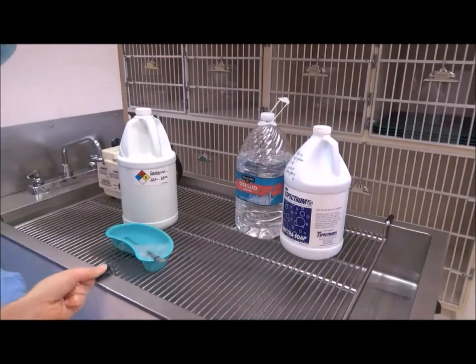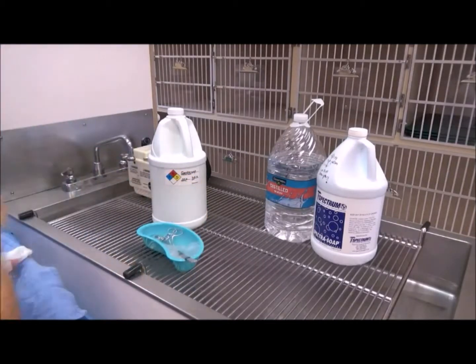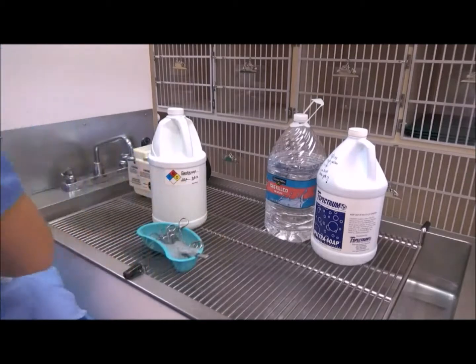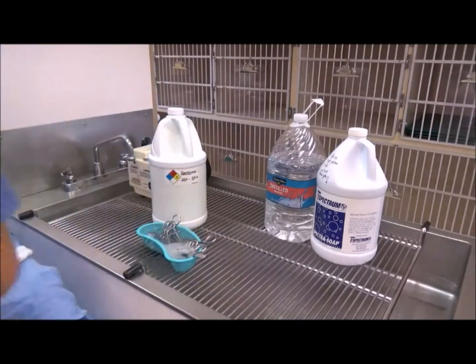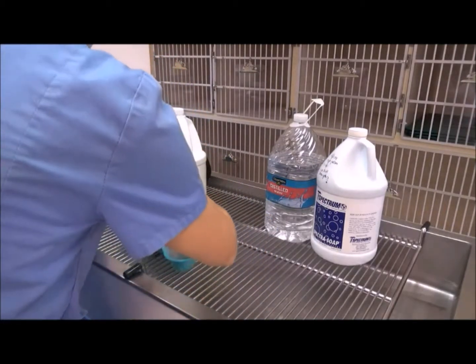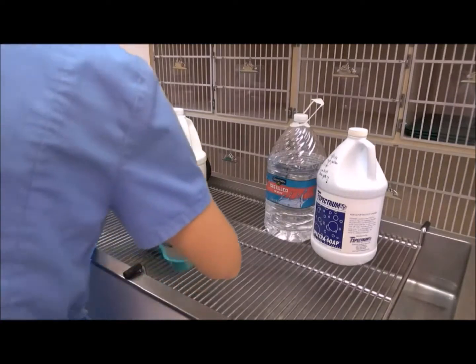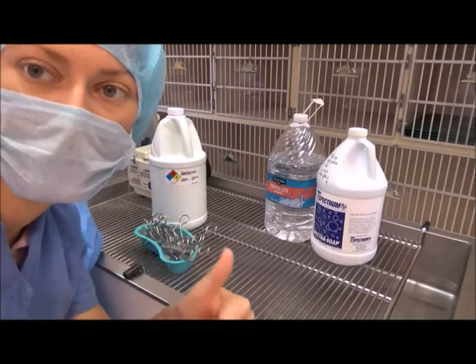It's specifically used for surgical instruments. Okay, so that's perfect. All of our tools are present and accounted for.